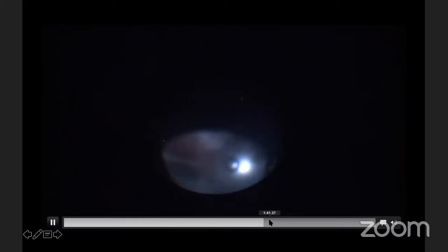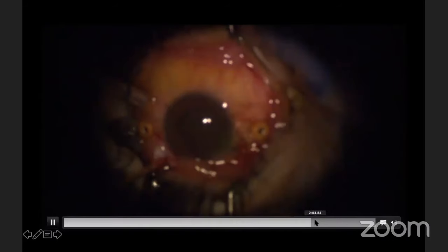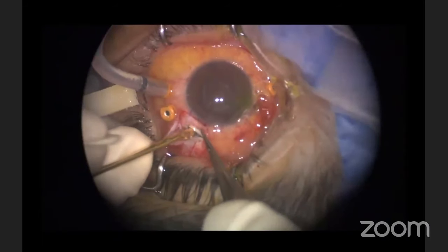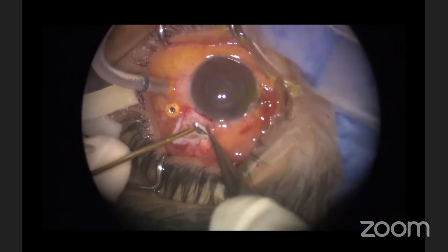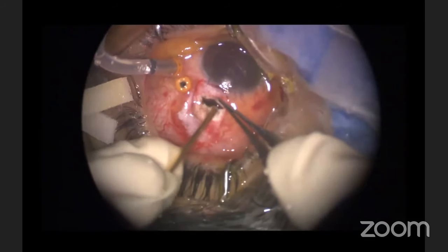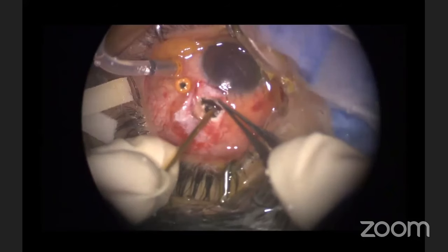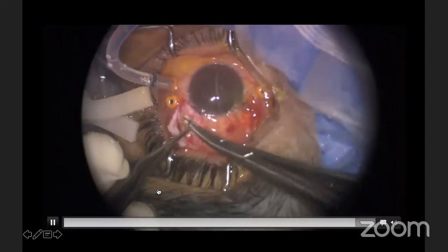Just fill to the equator. We trimmed the vitreous around it. Then we inserted the intraocular foreign body magnet in order to remove it through a sclerotomy. Always be generous with the sclerotomy in cases where you are not sure about the actual size of the foreign body. And this is out, and we switch to the sclerotomy.